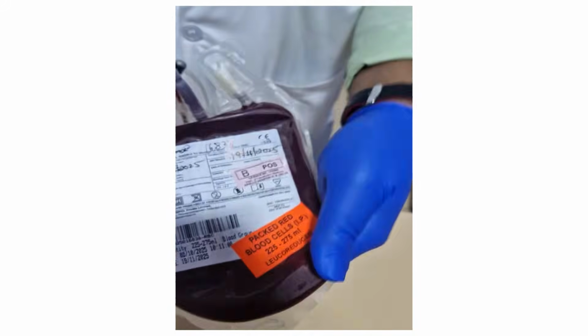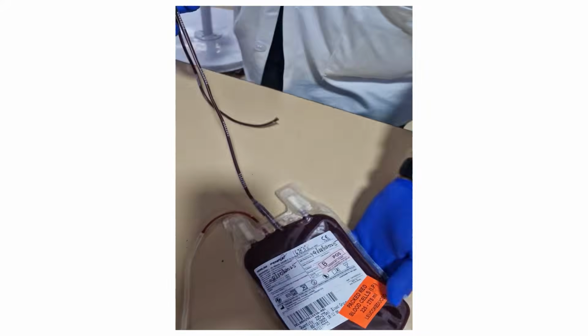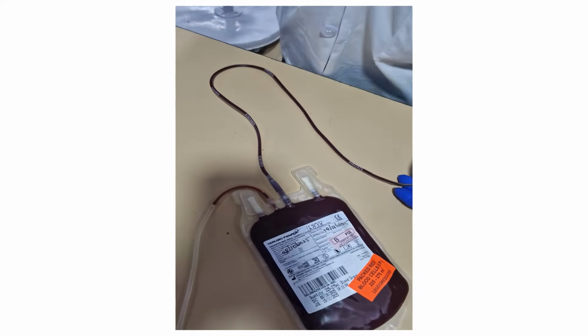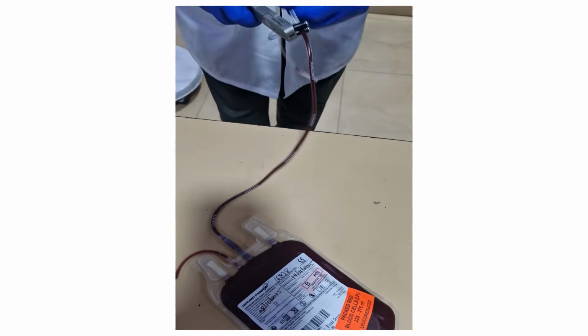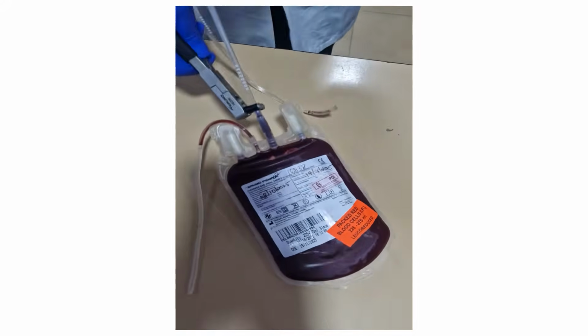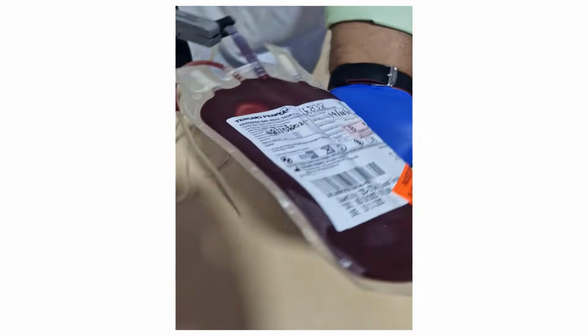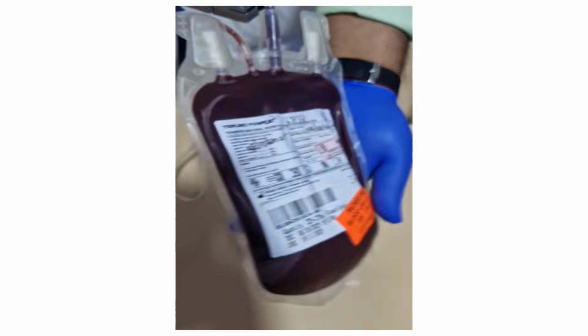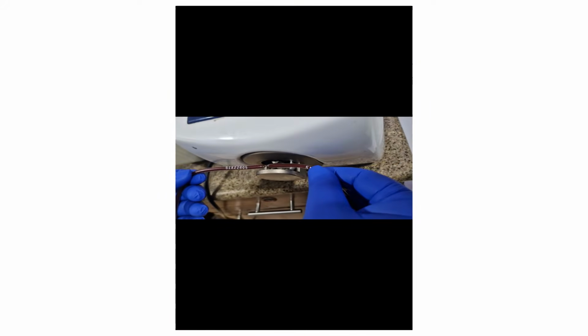This is a packed red blood cell bag which has been prepared by leucoreduction using an inline leucoreduction filter. Gently shake the bag and mix the content using a stripper. We take an adequate sample of the bag using a sealer. The segment contains an ideal sample of the bag representing the content of the bag.